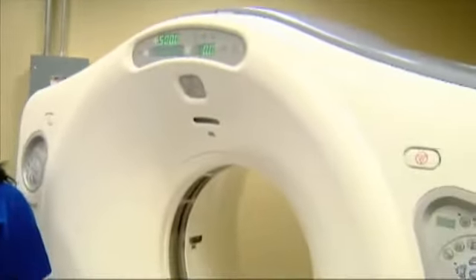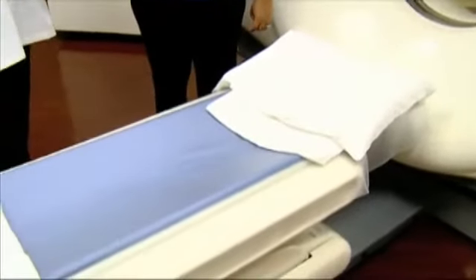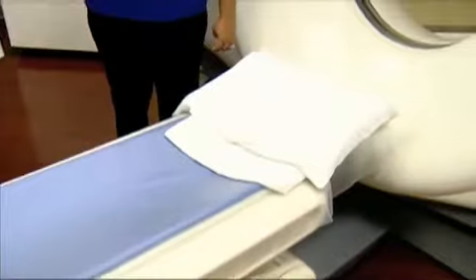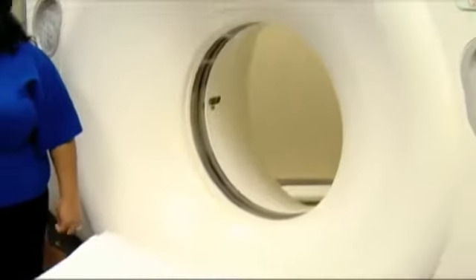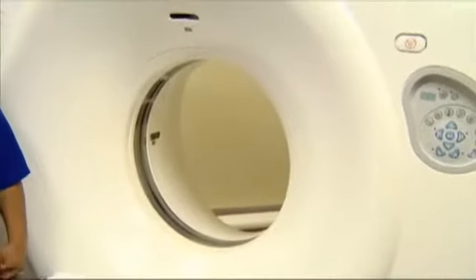All right. And so kind of take us through the process. For a CAT scan, I was thinking head, but you said no, it's for several different types of injuries. Kind of talk about the different injuries that you need to be associated with this machine. Okay, most primarily, especially in the football players in the community who suffer, unfortunately, a concussion, they'll be brought into the emergency department for evaluation, and should it be necessary, we can do a CAT scan of the head. We are specifically looking for injury to the brain.